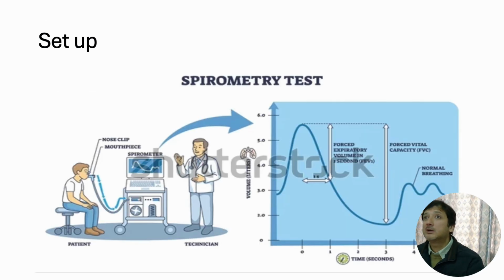So this is a typical presentation of a setup of spirometry. Here there is a spirometry machine. There is our patient who blows into the mouthpiece, and then we also use a nose clip so that the air doesn't go out from the nose, and the recordings are seen in the graph as you have seen there.